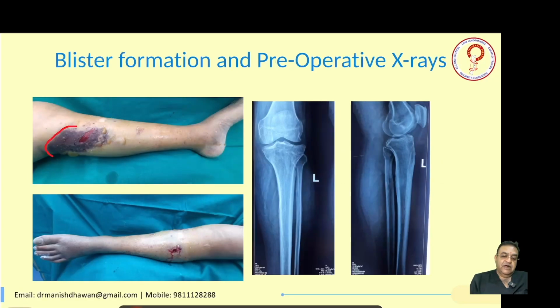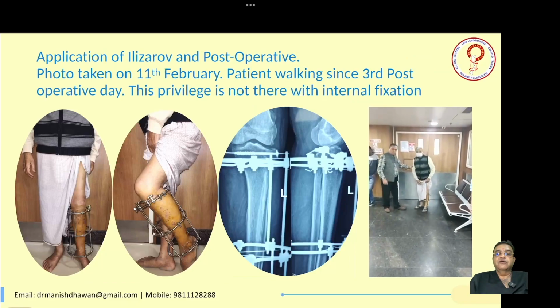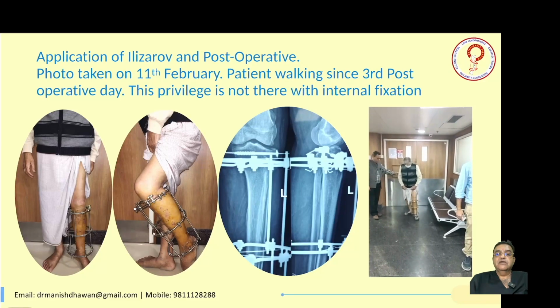You can see the damage to the skin, and you can see the raw wound also. So primary Ilizarov fixation was done on the same day. Here is the patient with the frame, and you can see he is not using any walker or a stick. He is able to put weight and walk.